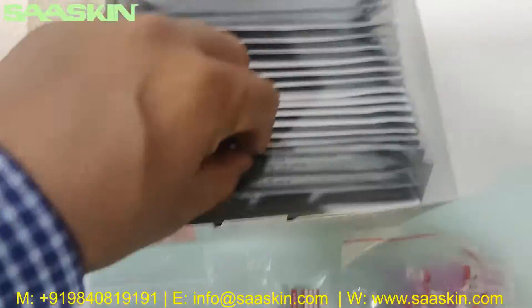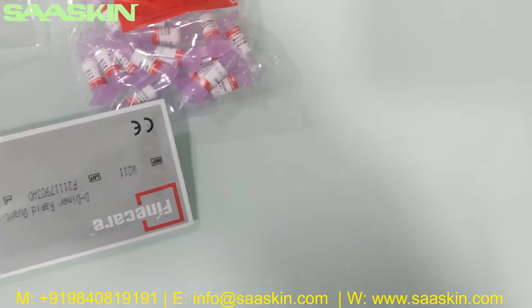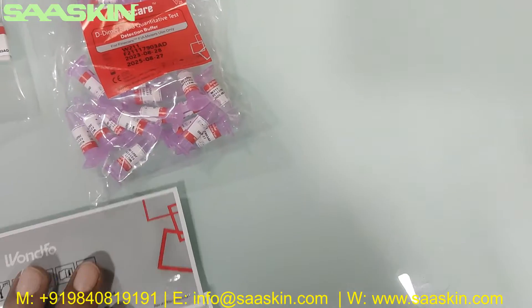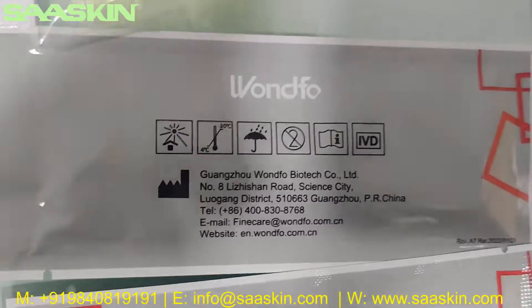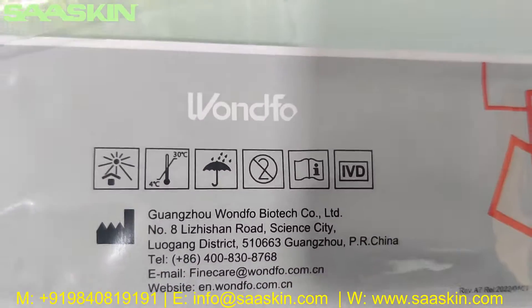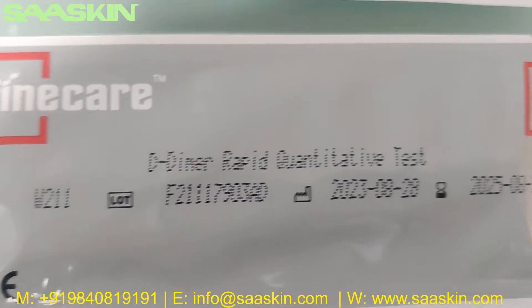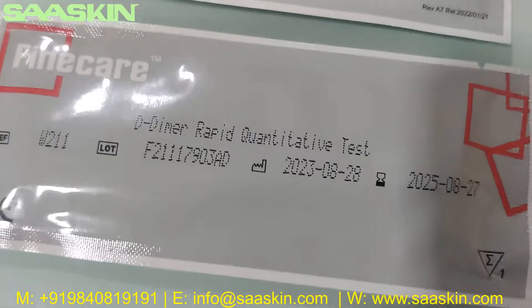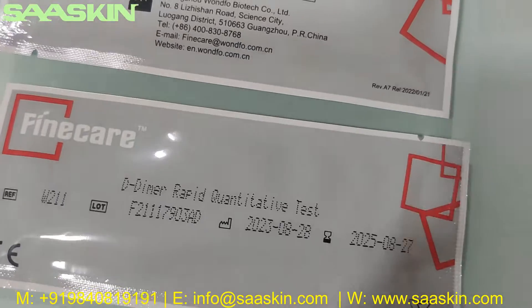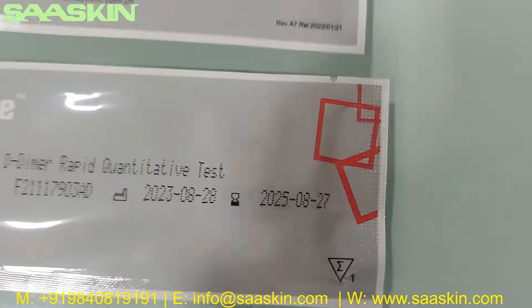Further inside the box, you have 25 test cartridges. Let me pull two out for you. You can see the other side of the pouch, which shows the manufacturing location and the company. It says FineCare D-Dimer Rapid Quantitative Test — 25 test kit — and it has a lot number as well as the expiry period.